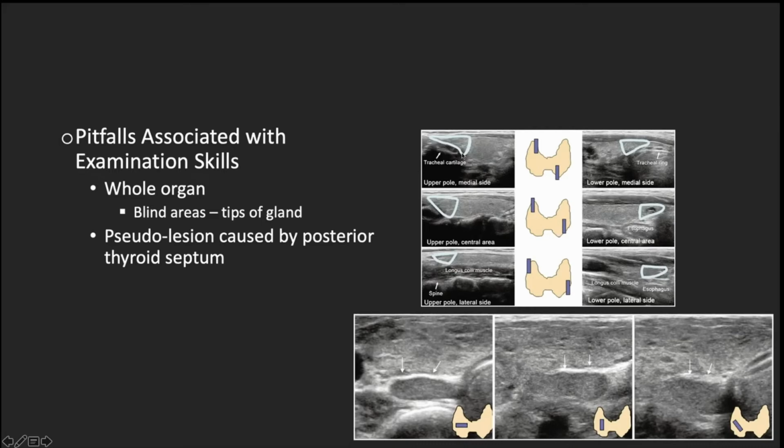So you know that you have reached the upper limit and also the lower limit of the thyroid gland. But sometimes, in thyroid enlargement, there can be retrosternal extension, which goes further deep into the thoracic inlet. Using ultrasound it is difficult to assess, but we know then in our comment that this thyroid enlargement is not just within the neck, but has gone into the mediastinum and extends retrosternally.